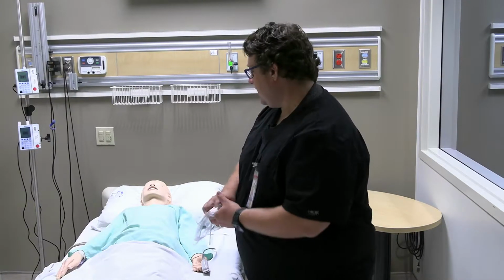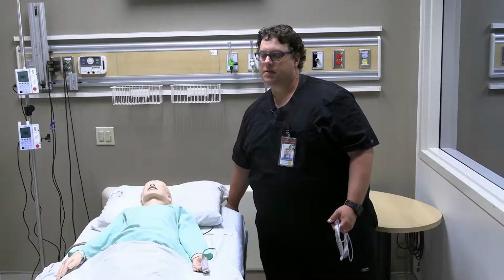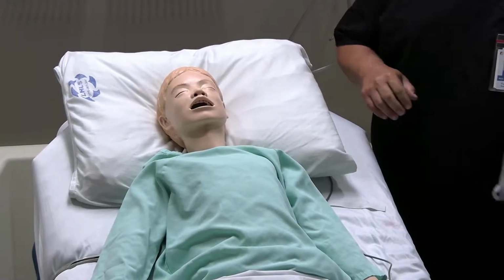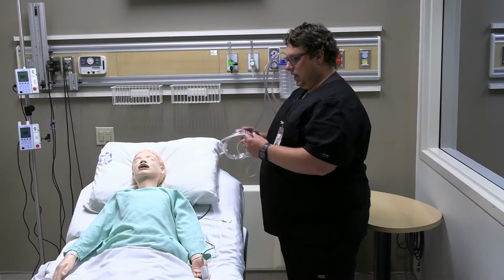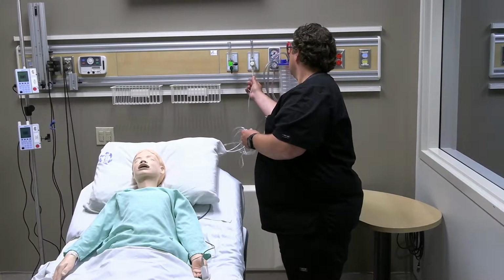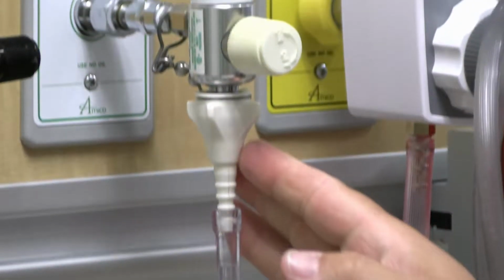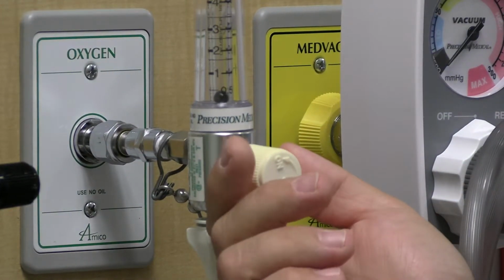One of the most important things when you have a patient who is in some sort of respiratory distress is proper positioning of your patient. So get them upright as much as you can. You then are going to go to your wall and attach your nasal prongs to your flow meter. I am now going to take the oxygen end of the prongs and attach it to my oxygen flow meter here at the oxygen nipple.